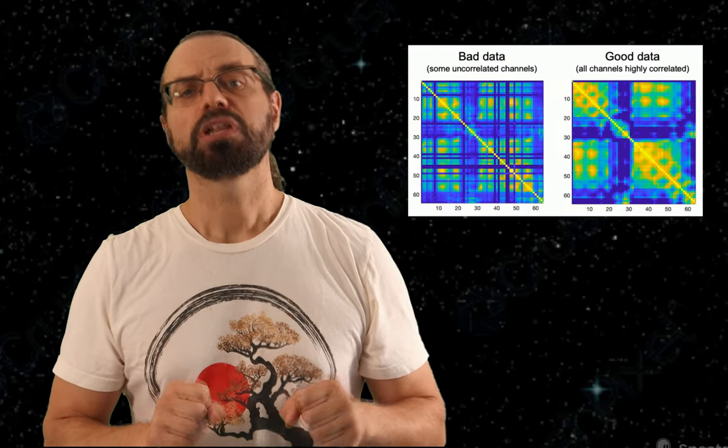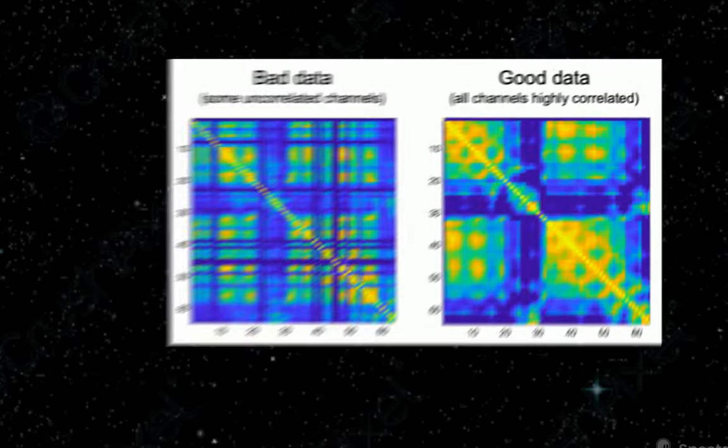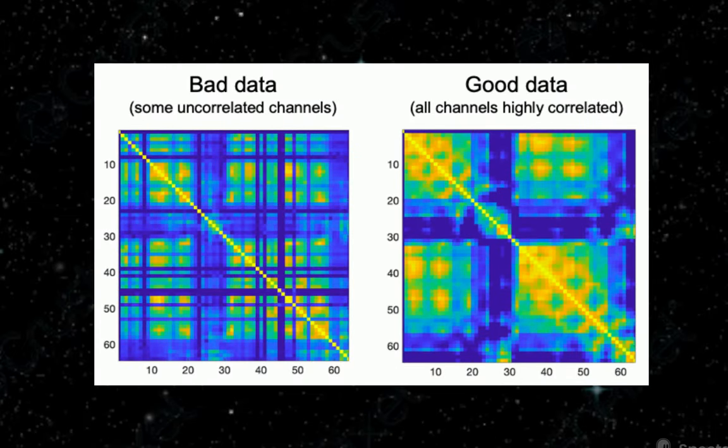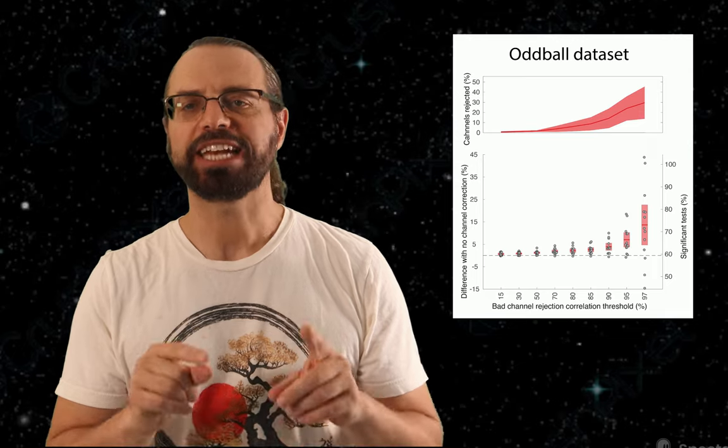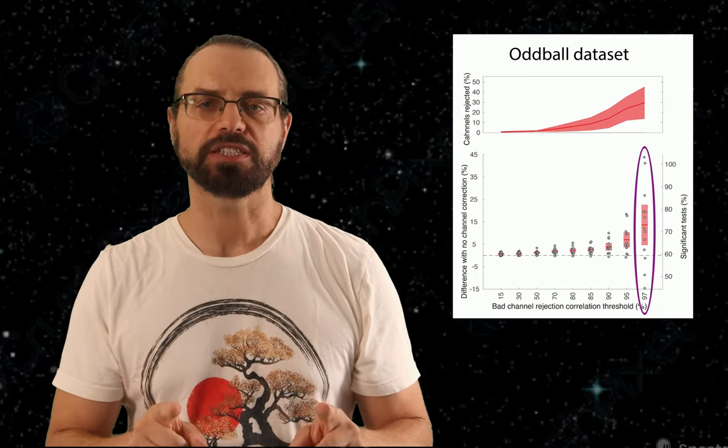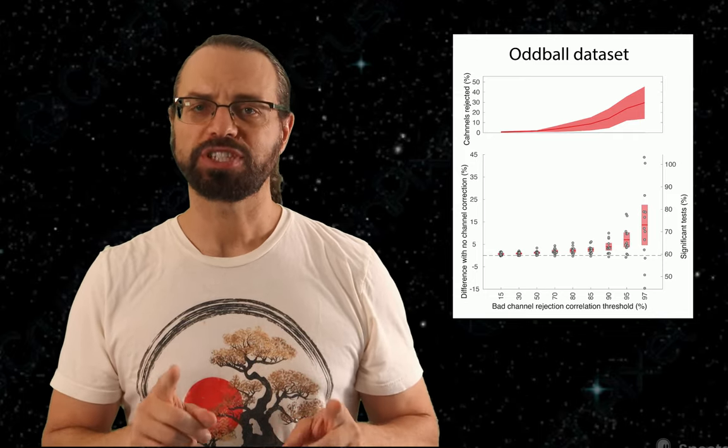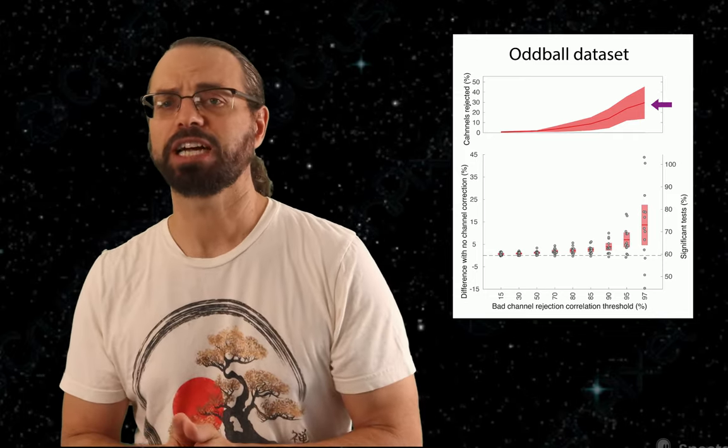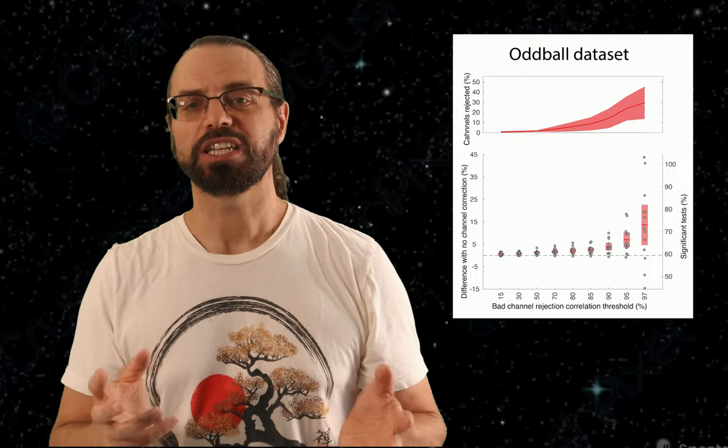Finally, we tested different methods in EEGLAB. Unlike the other software we tested, we had to choose because there are 34 plugins in EEGLAB to reject artifacts. We focused on the default methods included in the core EEGLAB distribution. First, EEGLAB allows the detection of bad channels based on their correlation with each other. A channel that is not correlated with others is likely an artifact. We have found that removing channels correlated less than 95% for the face and 97% for the oddball dataset increased significance. However, the 97% threshold also removed 30% of the channels on average, so it is not realistic to use it in practice.